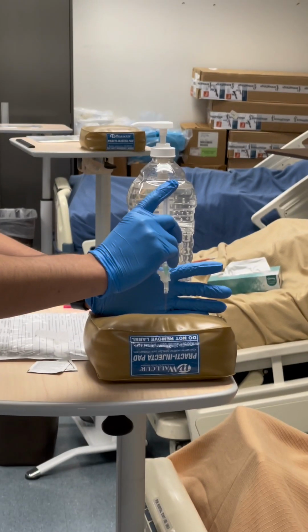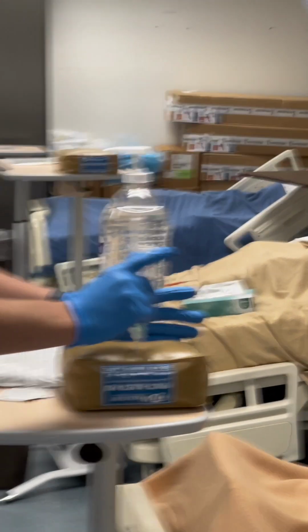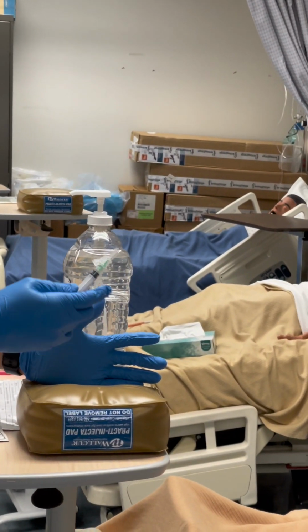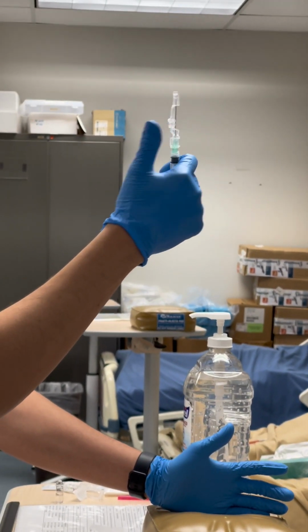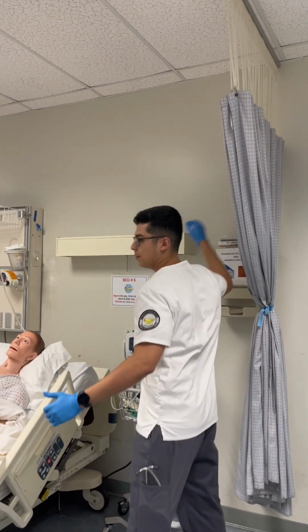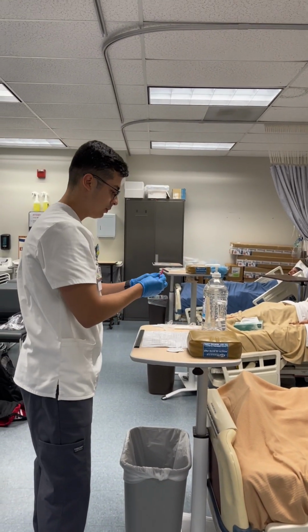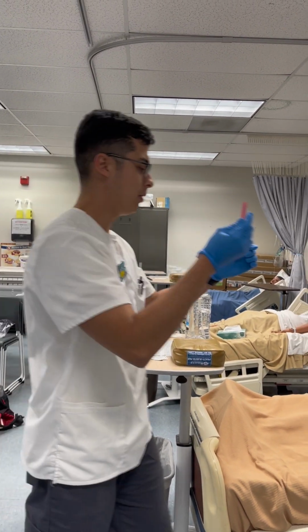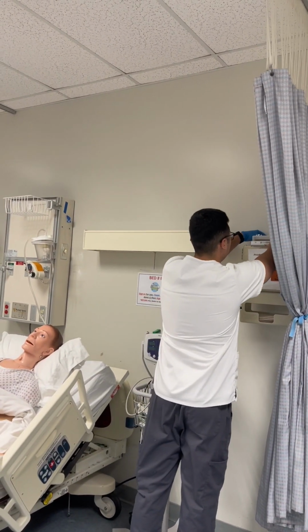And then I'm going to administer at 90 degrees. Immediately I'm going to put on the safety. Put on this one. Okay. Immediately dispose of this. Awesome. So safety needle, filter needle and the Compazine, I'm going to dispose of it in the pharmaceutical waste.